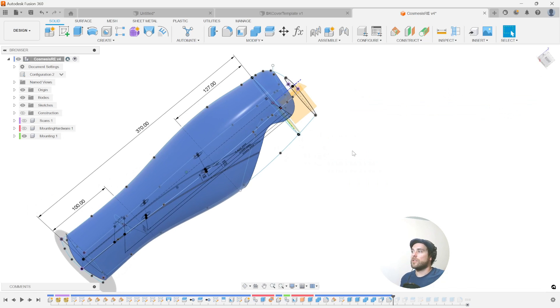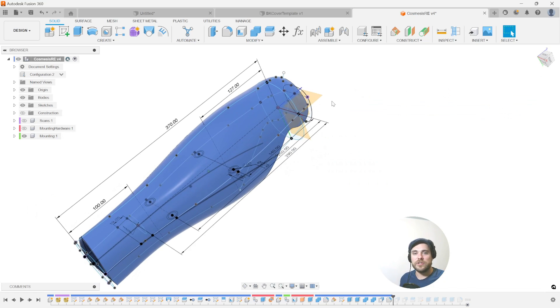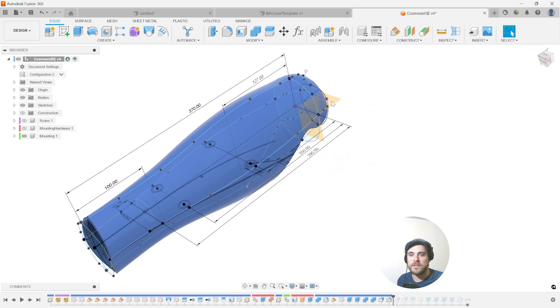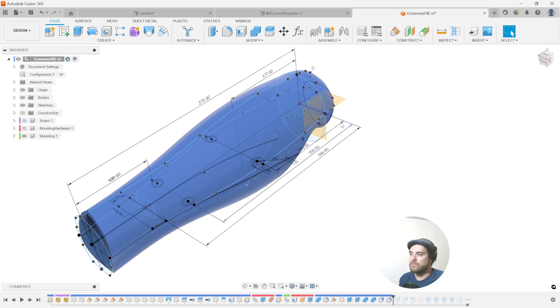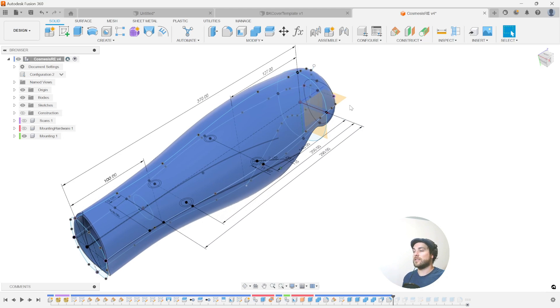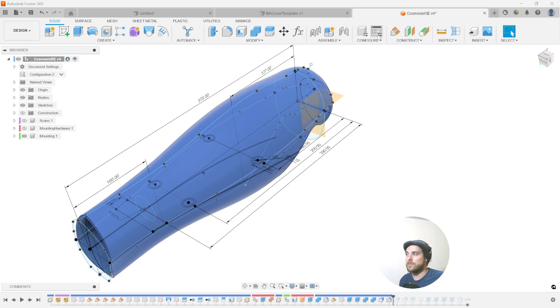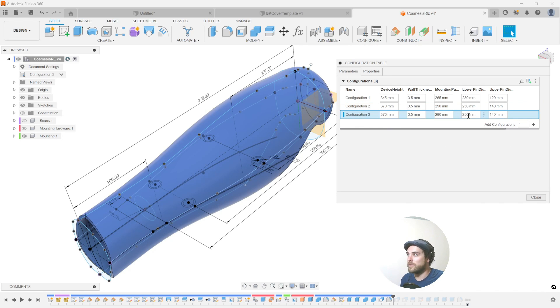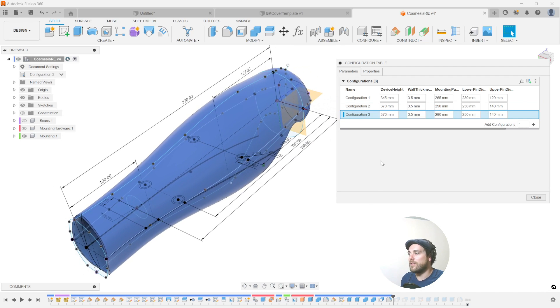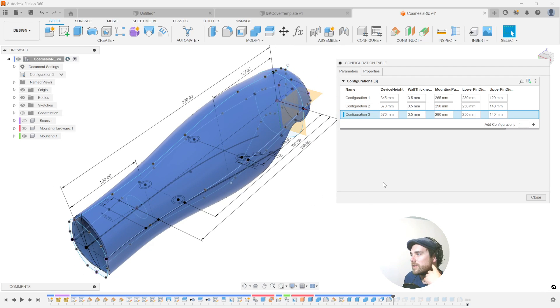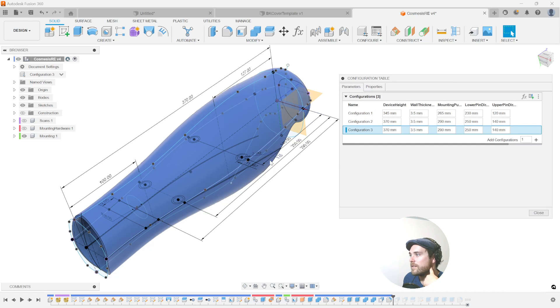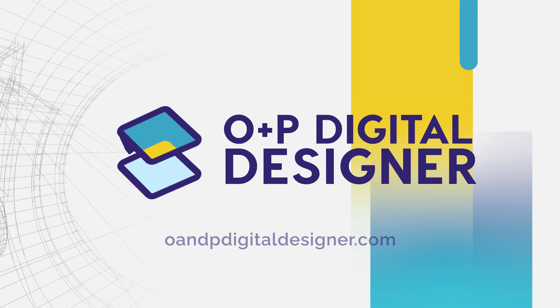So really cool way to create a template, share a template, and have others drive the template. Once you create a robust parameter that doesn't fail and that creates a consistent result, you can program it with a configuration table and send it off to different people to create their own configurations for their own patients. I hope you guys can see the value of this kind of tool. It's an exciting new addition to the Fusion 360 database. And tune in next time for another hot tip and trick with O&P Digital Designer.